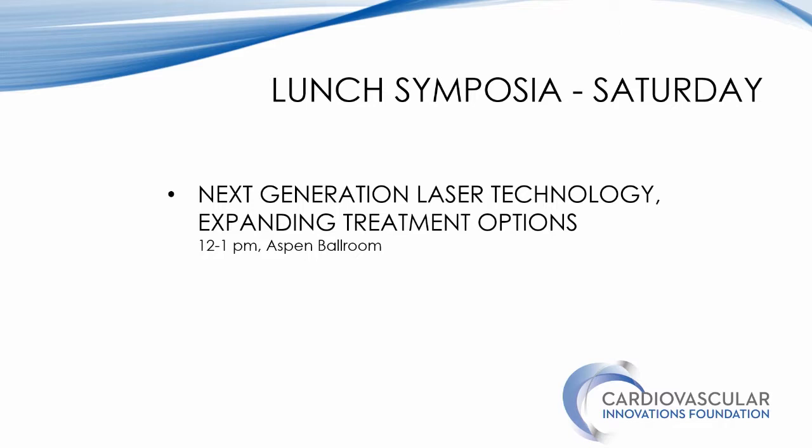And I think that when you look at 2-3 year data, a lot of these lesions are going to be calcified. There could be very long lesions in these patients with Rutherford class 5 disease. I find myself stenting these more than just using a drug-eluting balloon. I think in that patient population, I use it because I think of the long-term value of the scaffold. And I don't know if the data is there to back me up.